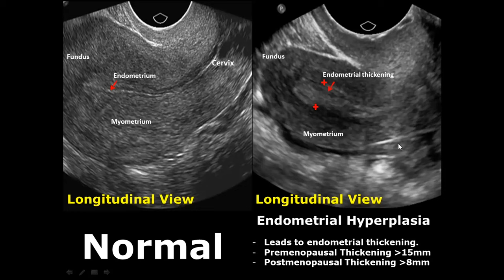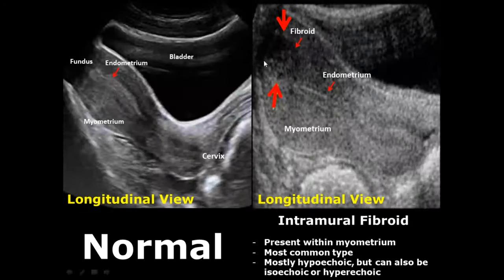Endometrial hyperplasia is the abnormal thickening of the endometrial glands leading to endometrial thickening. In premenopausal women, if the thickening exceeds 15 mm it is considered endometrial hyperplasia. In postmenopausal women, if the thickening exceeds 8 mm it is also considered endometrial hyperplasia.